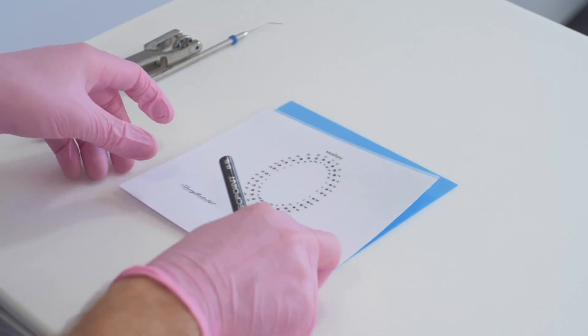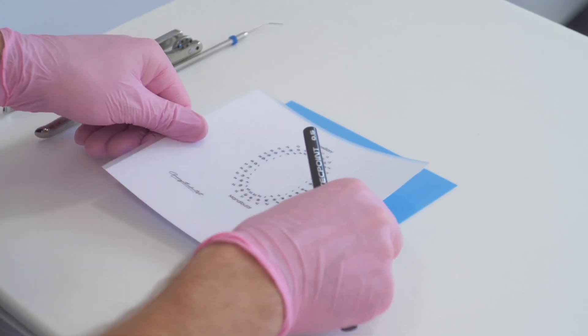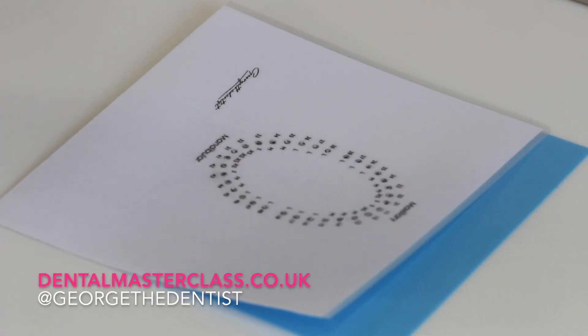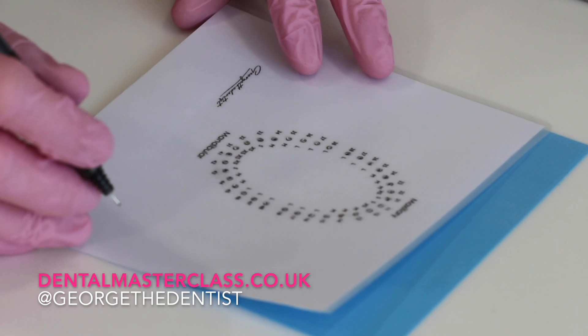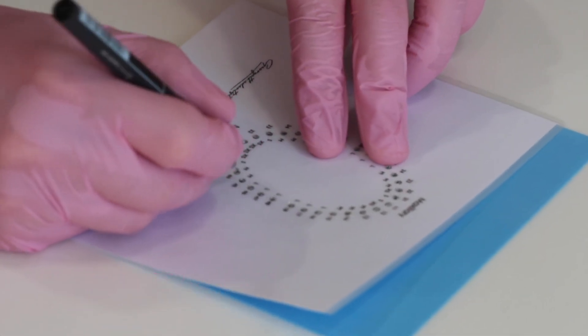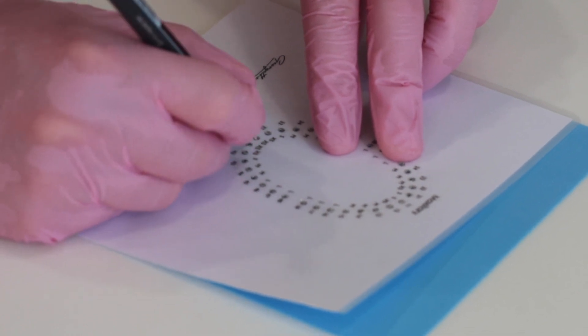Take a rubber dam stamp, aim it towards the centre of your rubber dam, then use a little pen and just mark on here using the stamp where the teeth are to be. I'll go from seven, six, five, four, three, two, one.